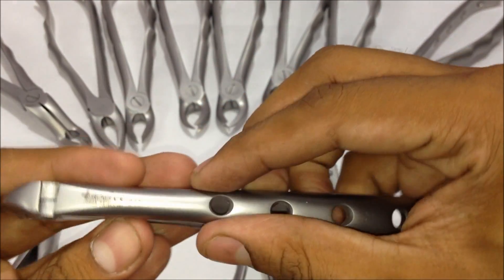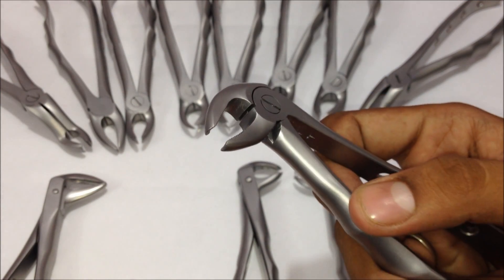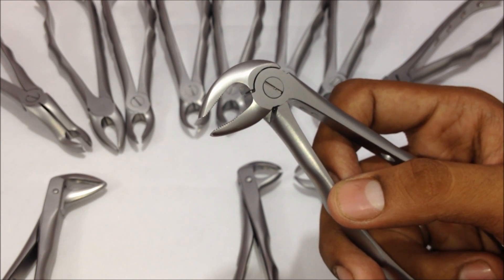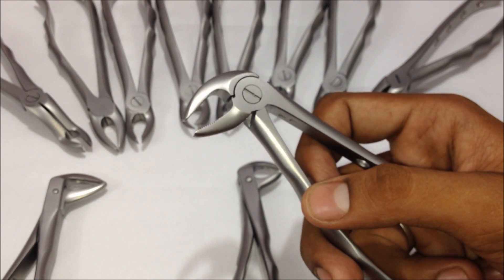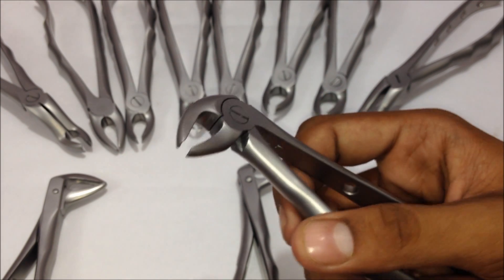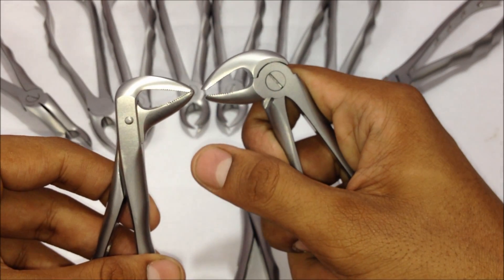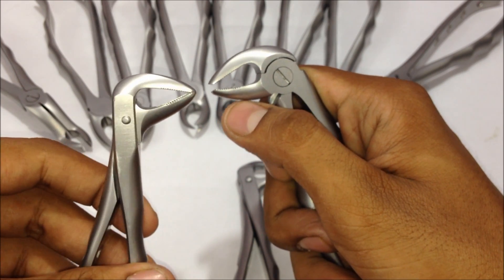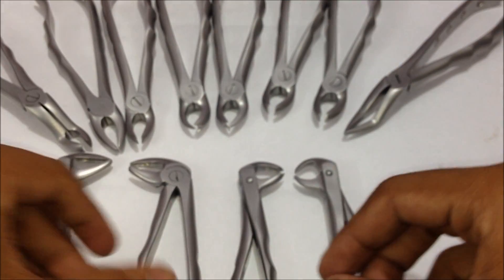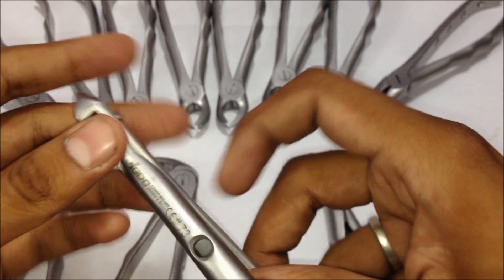The next one is the lower premolar forceps, number 13. This forceps is used for any premolar extraction in the lower jaw — mandibular left and right premolars — whether for normal extractions or orthodontic therapeutic extractions. You can see the distance between the beaks in the premolar forceps, compared to no distance in the root forceps for the lower jaw. This is the number 13.